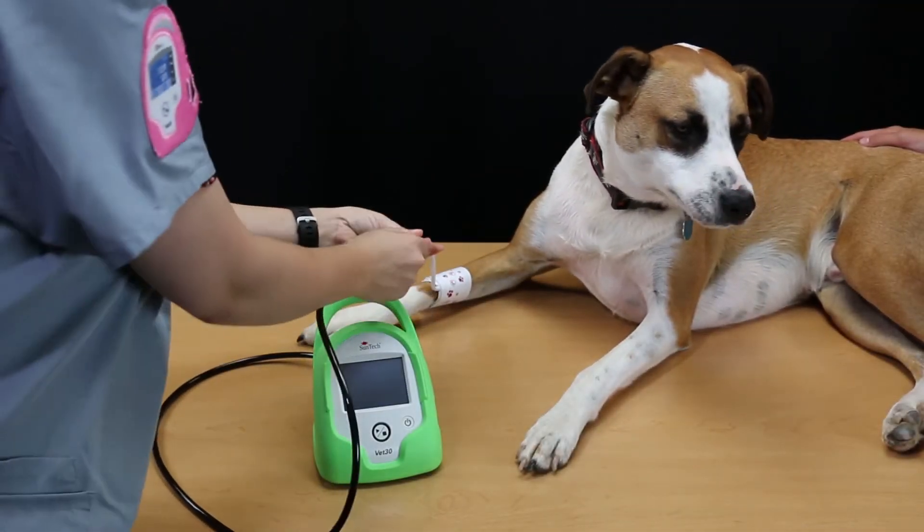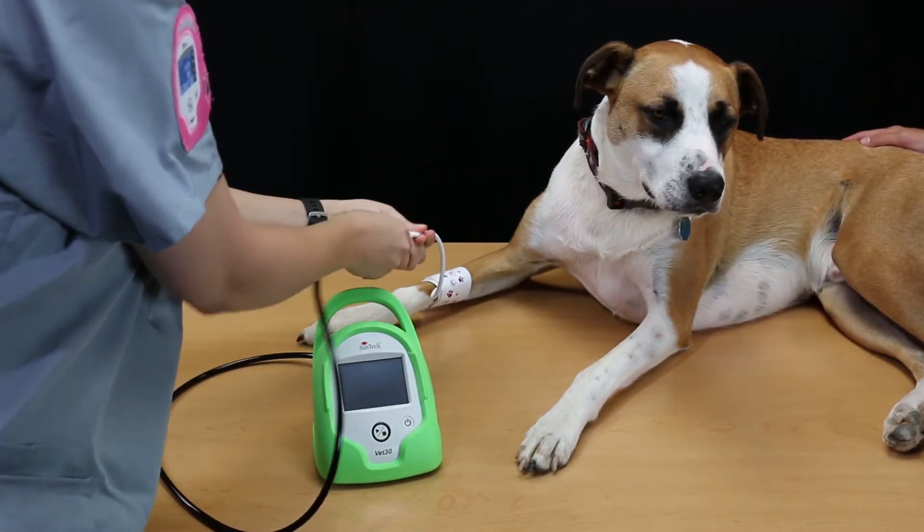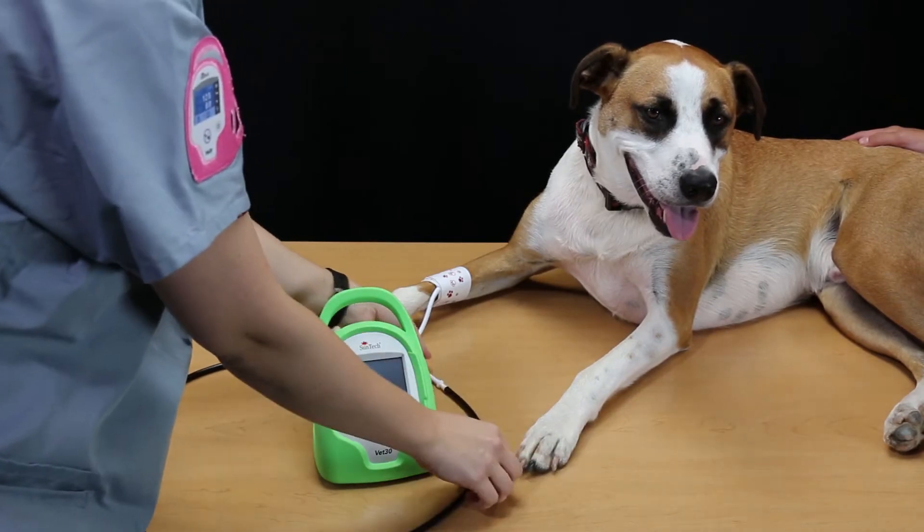With the proper cuff in place, connect the cuff to the patient hose of the SunTech VET30 Continuous Vital Signs Monitor.